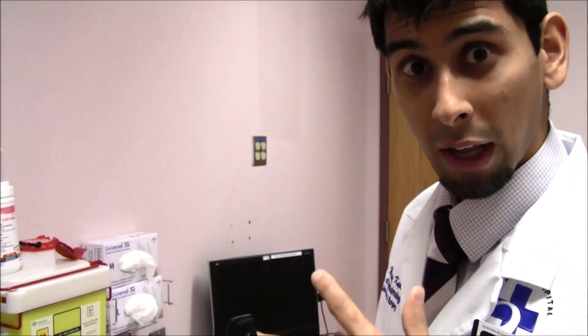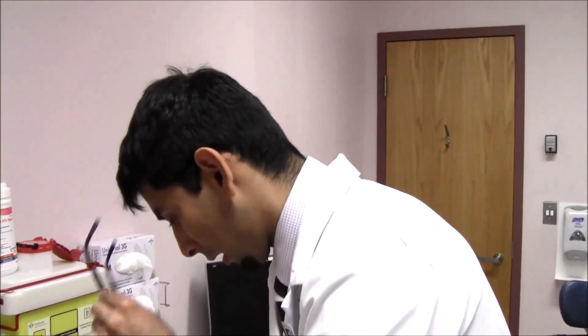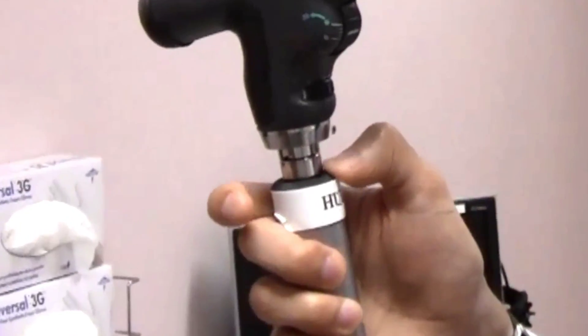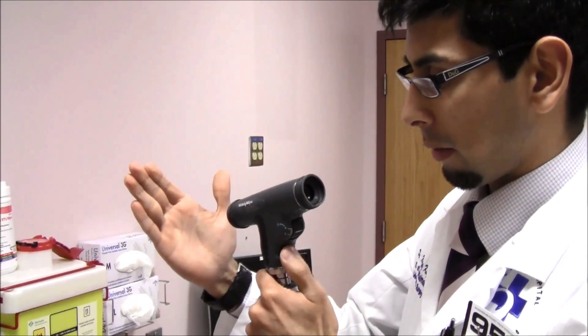Let's go ahead and look at how to start using the panoptic ophthalmoscope. I'm going to set the direct ophthalmoscope down and pick up the panoptic ophthalmoscope. Once again, to turn it on, depress the green and rotate, and you'll see that the light is present.